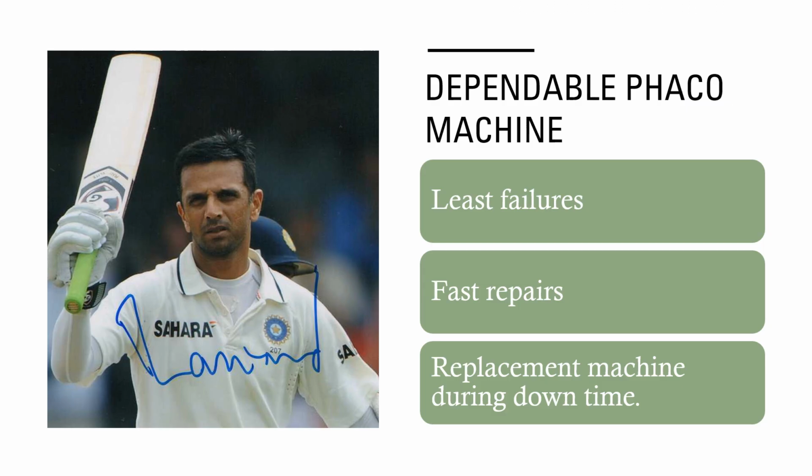And then there is something like dependability. They should have least failures and should have fast repairs, and the company should be able to provide you with a backup machine during the downtime, so that doesn't affect your business.